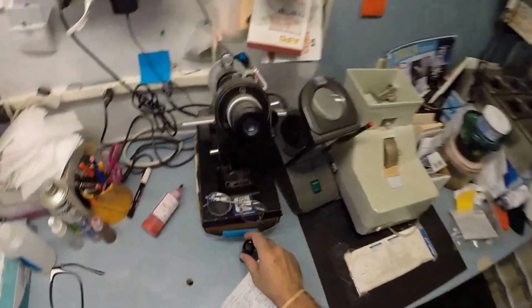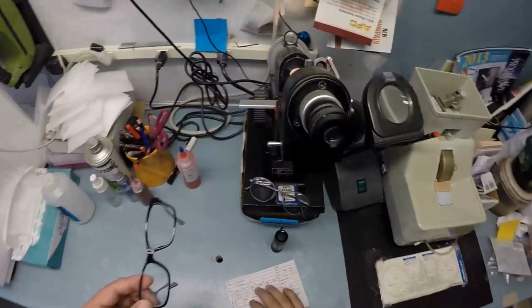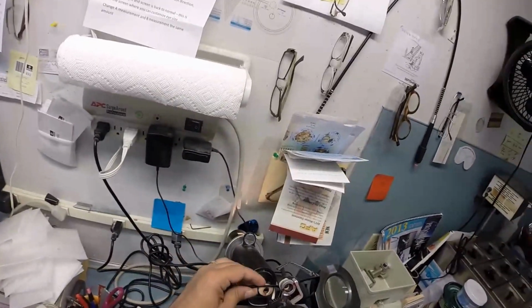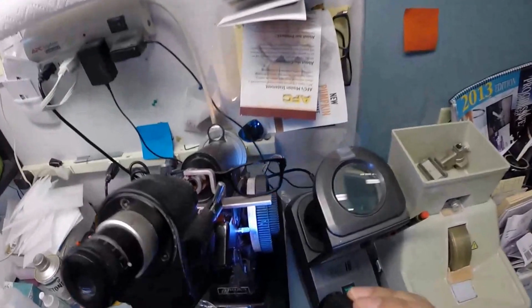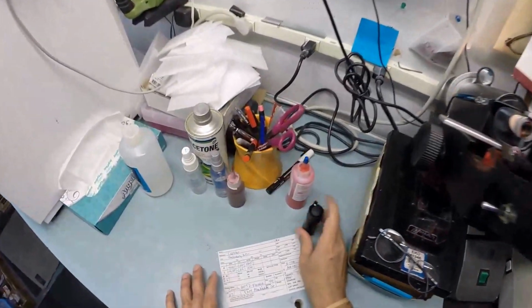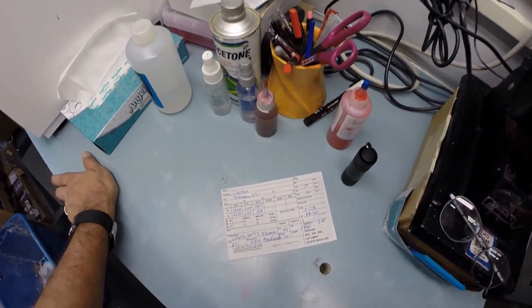I'm going to come back down here to the lensometer to verify your prescription. I'm going to turn the axis wheel back to 65, and I'll explain all that in just a moment. I'm going to put your lens in just above that red dot, which is your optical center, and measure, and I am getting -4.